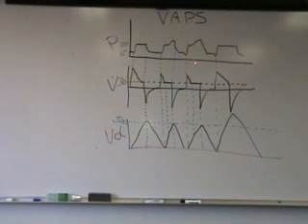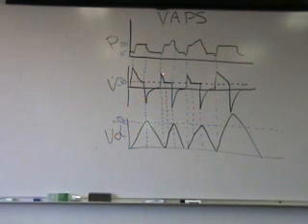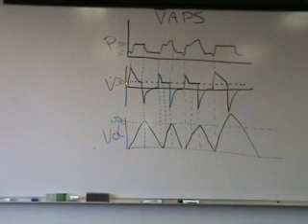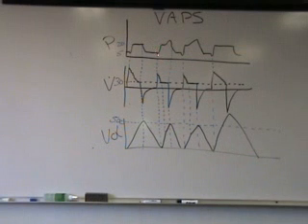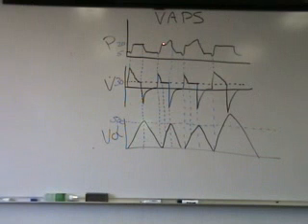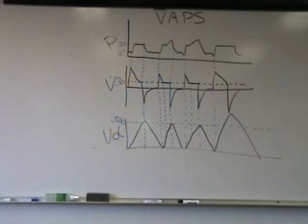On the breaths that the volume target was not achieved by the time the flow rate decelerated to your set flow rate, those breaths you would have to classify as patient triggered, initially pressure limited, but then turning into a volume breath and volume cycled at the end of that breath.